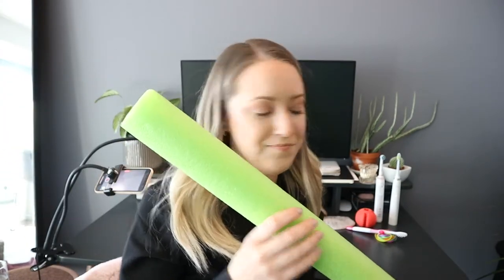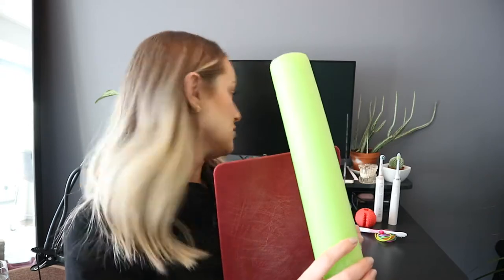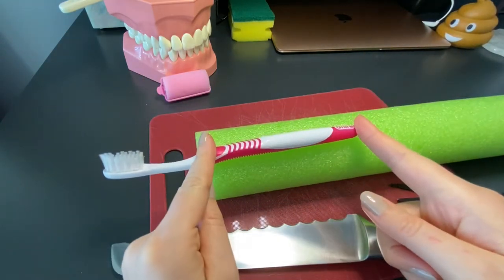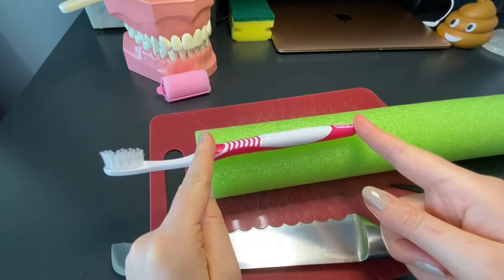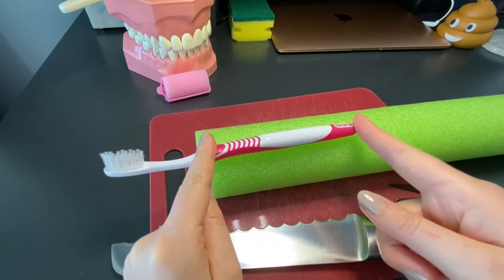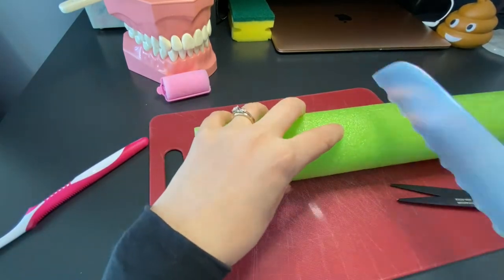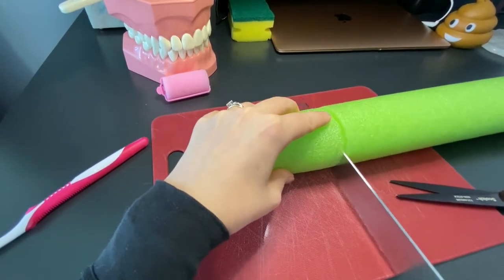The second way might seem a little bit ridiculous, but I'm going to use a pool noodle to make your toothbrush handle really wide. I'm going to get a cutting board, a sharp bread knife, and the pool noodle. What I usually tell people to do is just measure the length of the handle of the toothbrush — that's about how long you want the pool noodle to be. Mark the spot and then take the bread knife and just chop it through.